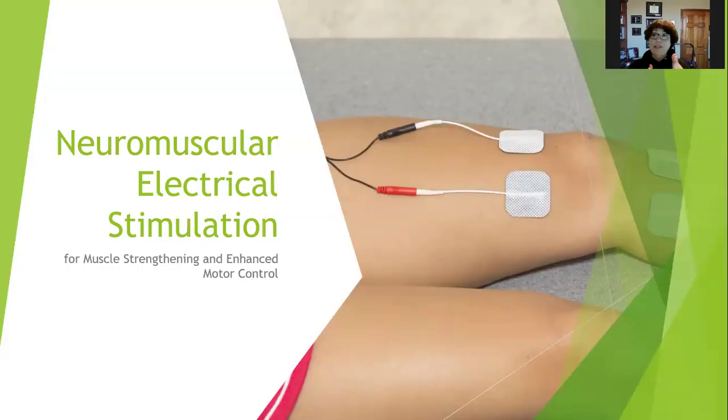All right. So having experienced a lot of electrical stim, now we want to just delve into the nitty-gritty. The major indications for electrical stim are muscle strengthening and pain management. Those are really our major considerations, even though there are some subcategories within that. That is normally what we're going to be doing with eStim. So we'll start with muscle strengthening and then we'll have some separate lectures on pain management.